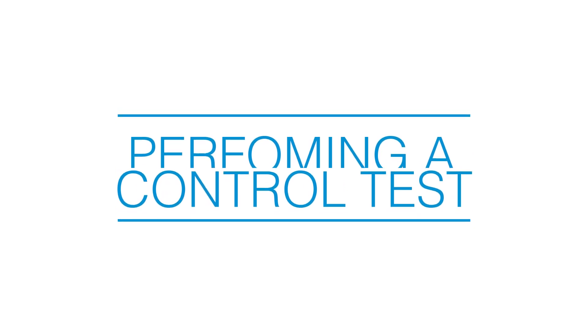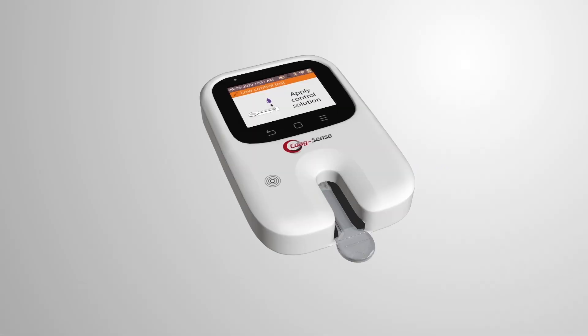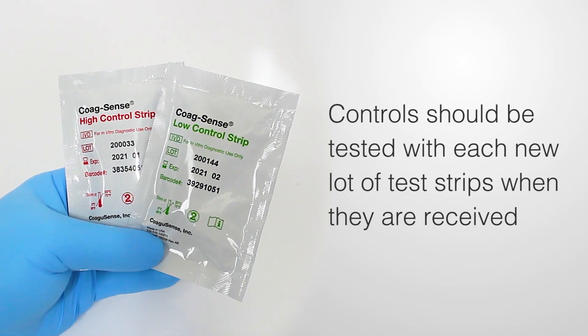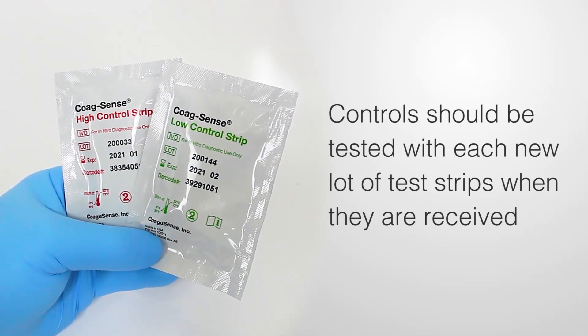Performing a Control Test. This video provides a brief overview of how to perform a control test. Controls should be tested with each new lot of test strips when they are received.